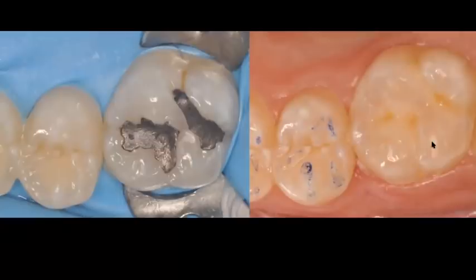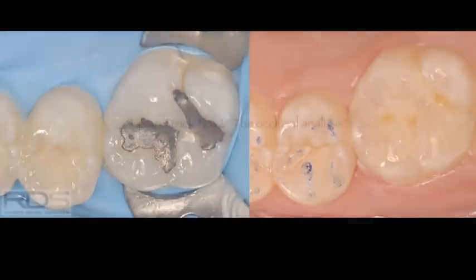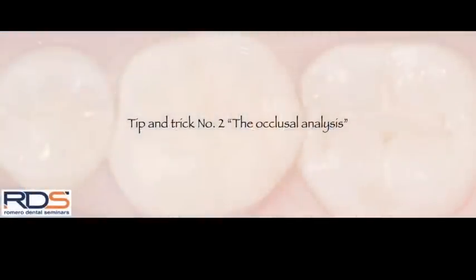It may take you a little bit longer at the beginning only to get used to the technique, but when you get to the finishing aspect of your restoration, when you get to the finishing and polishing, it's going to be so much faster and easier, because you have now a restoration that looks more like a tooth than having just flat horizontal layers applied to your occlusal surface.